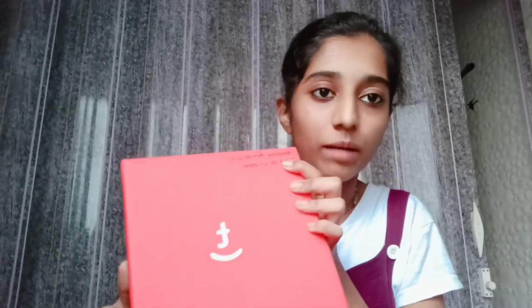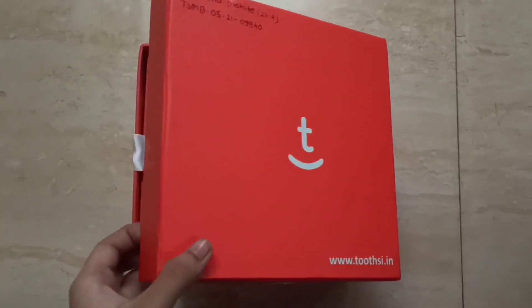This is the box from Toothsi. Here's my name, and I have 13 aligners. When I got the Toothsi box, I was so happy and I made an unboxing video. I'm going to show you that video and tell you what all materials they provide in this box.